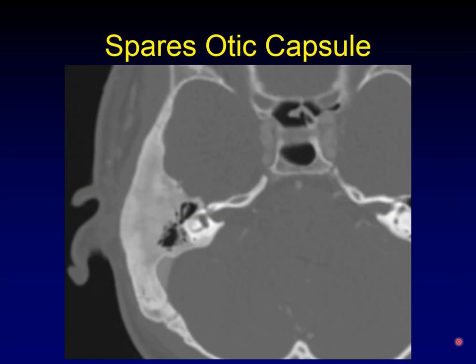Another famous feature of fibrous dysplasia is how it spares the otic capsule. You often get fibrous dysplasia of the temporal bone, but it stops dead right when it hits the otic capsule. You can see fibrous dysplasia all the way around, collapsing the air cells of the middle ear and mastoid, and yet the inner ear is pristine — absolutely preserved, even coming out and around the posterior semicircular canal.